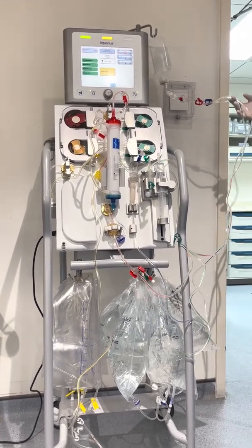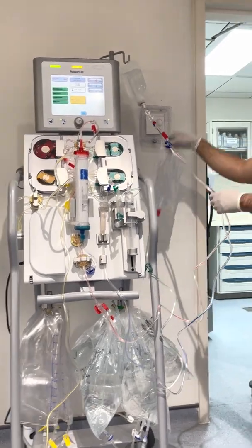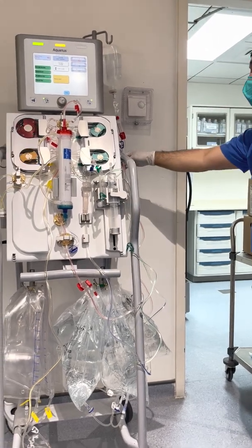See, we're not wasting normal saline. But if we did not connect it from here, we will waste more, 1 or 2 bottles.